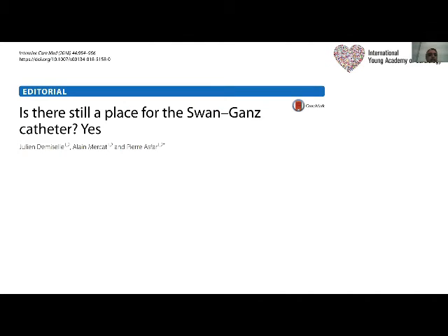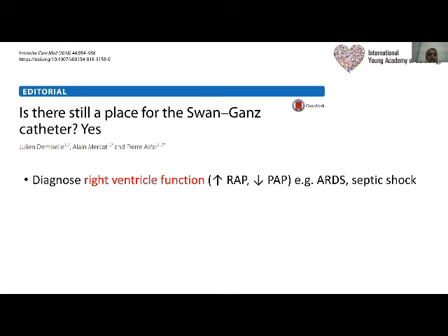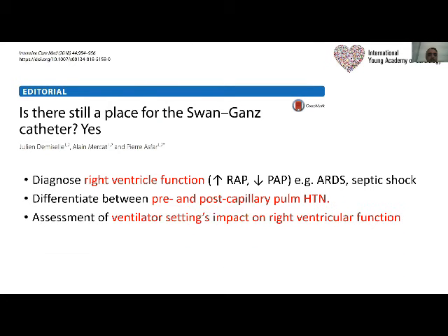And there is another interesting review, 2018. The question is, is there still a place for a Swan-Ganz catheter? The answer was yes, but in very specific situations. If you cannot diagnose the right ventricular function, especially with ARDS and septic shock patients, this is the time that you may need the Swan-Ganz. It's the only intervention that can differentiate between pre and post capillary pulmonary hypertension. If you want to know the effect of the ventilator settings on the right ventricular functions, you may use the Swan-Ganz.